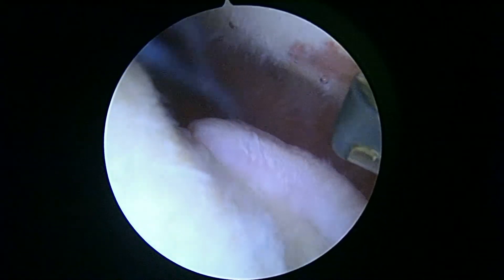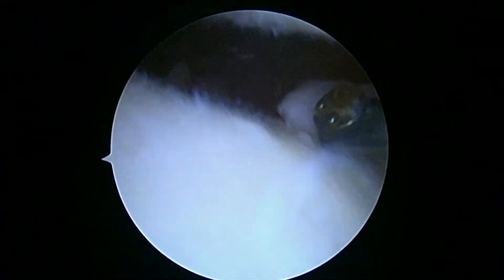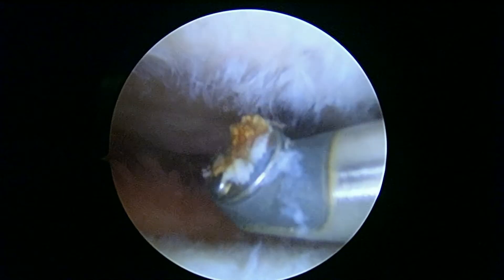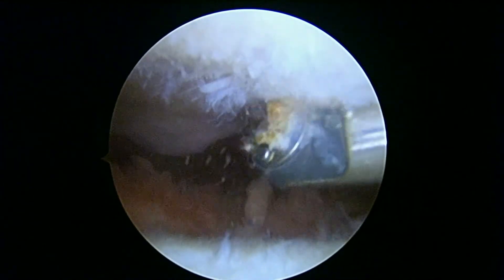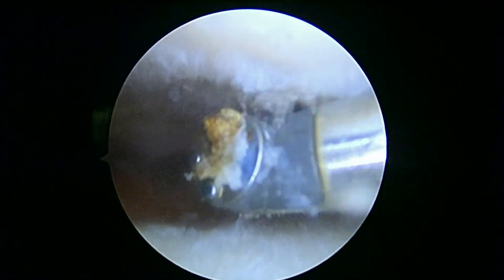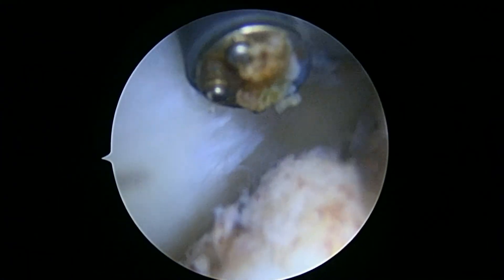Okay, so I want to get one final good look at the trochlea. You do have a fair amount of cartilage loss here. You can see the ridge underneath the patella. This device just helps us stop any bleeding, really — it has a little bit of suction on it. But we can see here that this is not smooth either. So I just want to give you that final look at the trochlea. So we're going to finish up now and get you back to the recovery room.